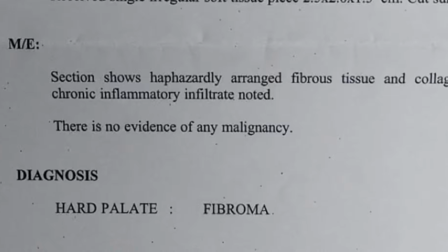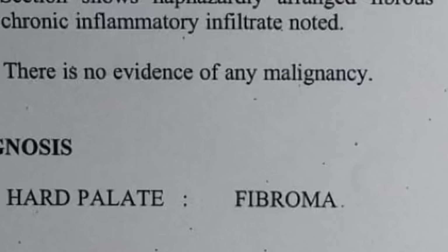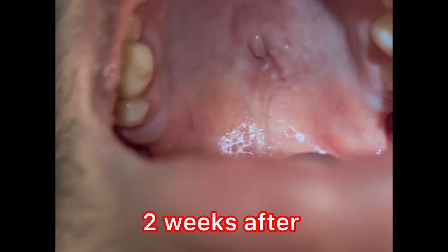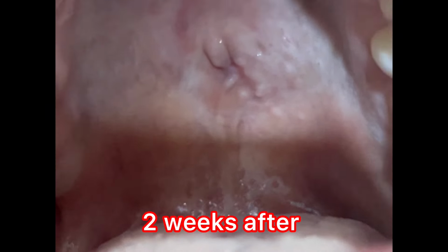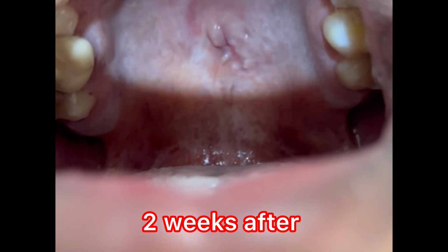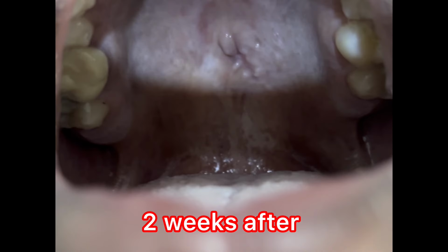The histopathological examination of the excised specimen confirmed it to be a case of fibroma. The hard palate dressing was removed after 3 days and the patient further visited 2 weeks after, which showed complete healing of the underlying raw area.